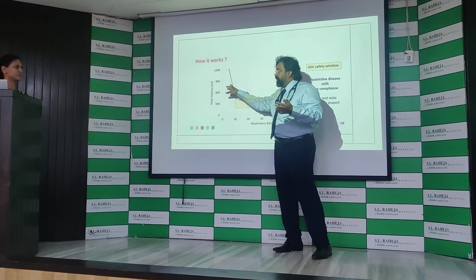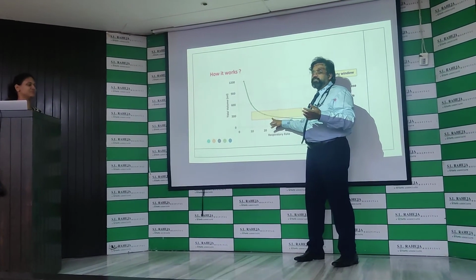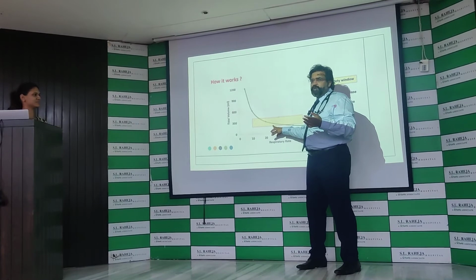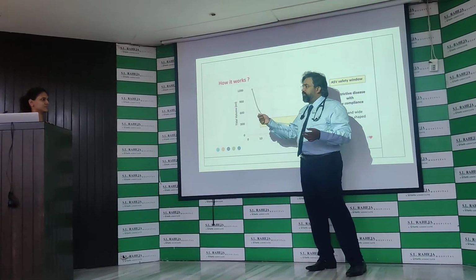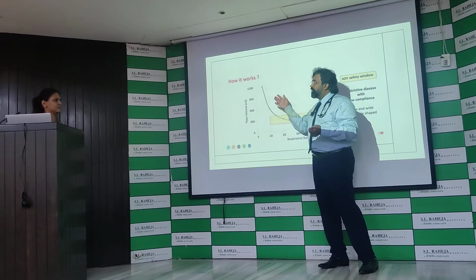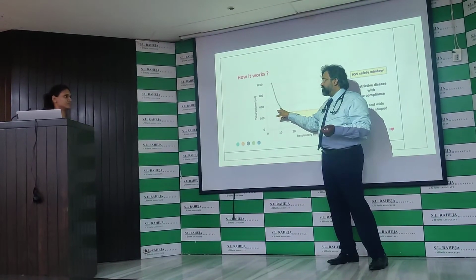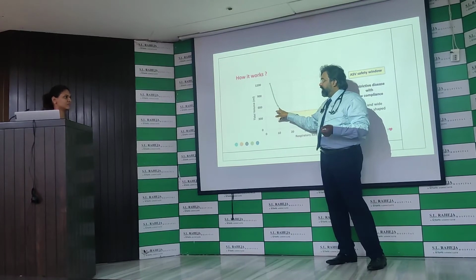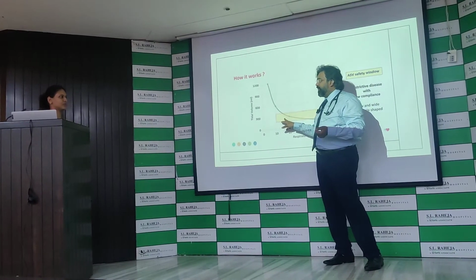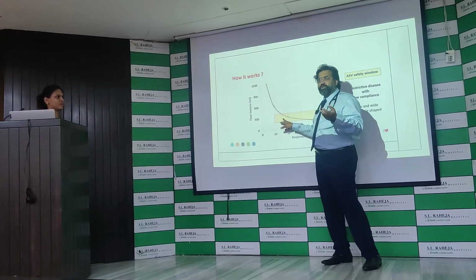It will not allow it to do that. Okay, yeah. It will change the pressure. It will get it back. Similarly, if you are doing all the adjustments, if the compliance has worsened further, and now this has gone out of the window, it will actually try to get it back here by changing the pressures in such a way, because essentially it's pressure control.